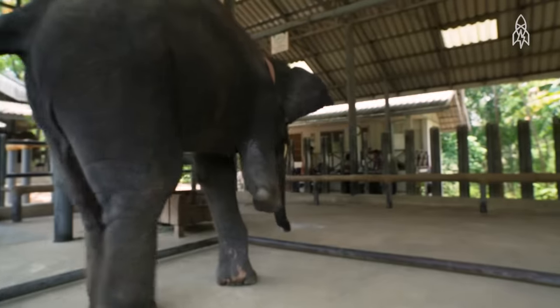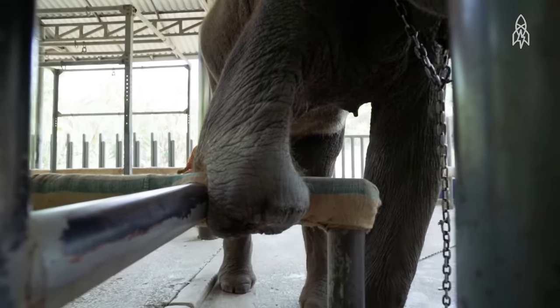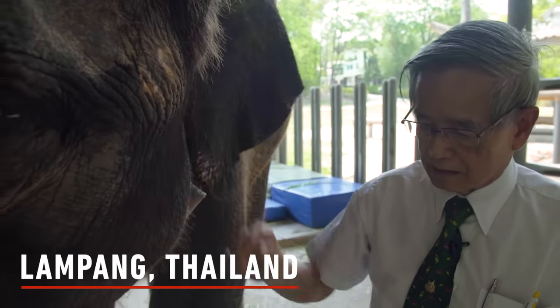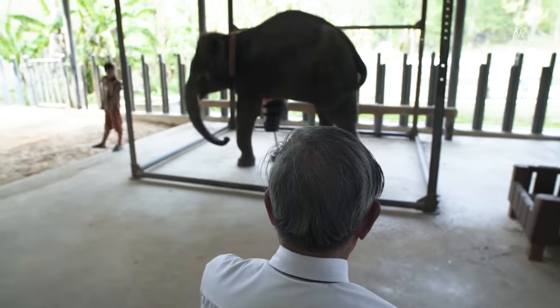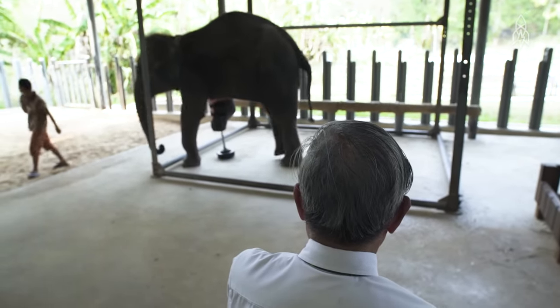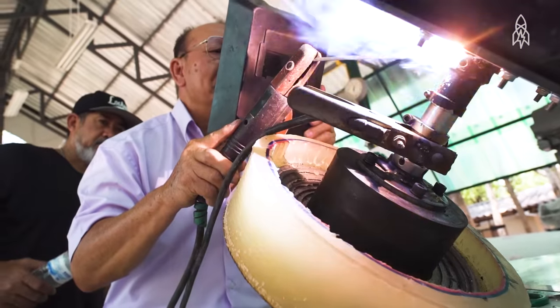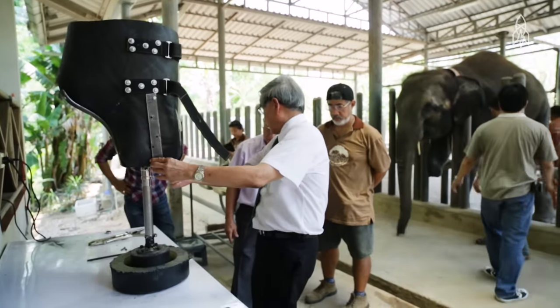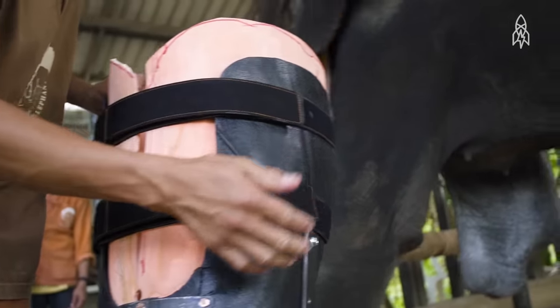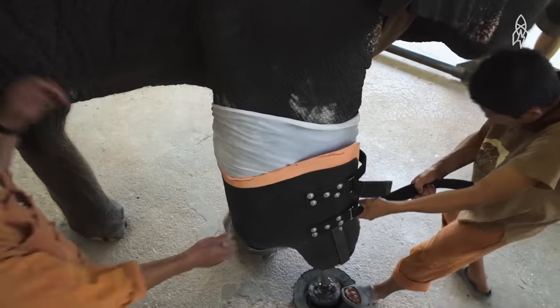Mucha lost her leg when she was two years old from a landmine. Dr. Ter Chai Chiriket is working with the world's first elephant hospital, located in Thailand. Since it opened, more than 4,000 injured and sick elephants have been treated. Using his knowledge as an orthopedic surgeon, Dr. Ter Chai designed Mucha's artificial limb when she was just a baby, accounting for the elephant's weight and size. As she has grown, pressure on the prosthetic has increased, causing it to break, so a new one is created every few years.